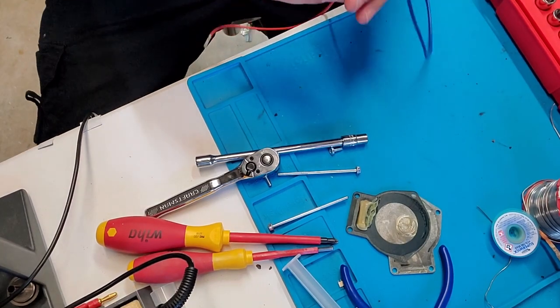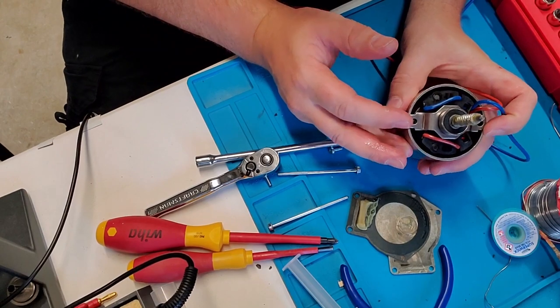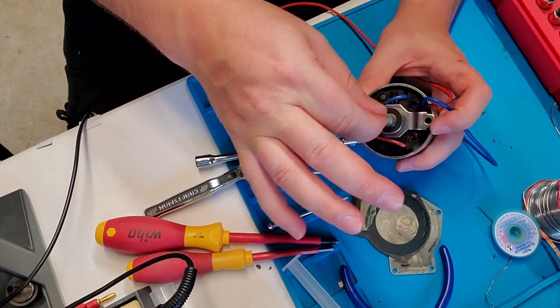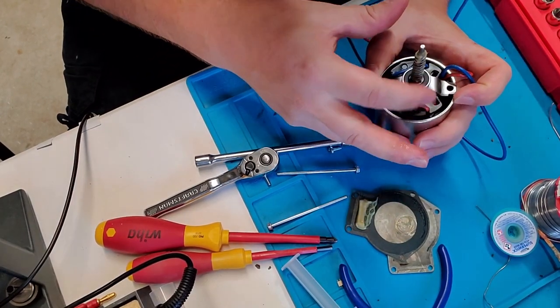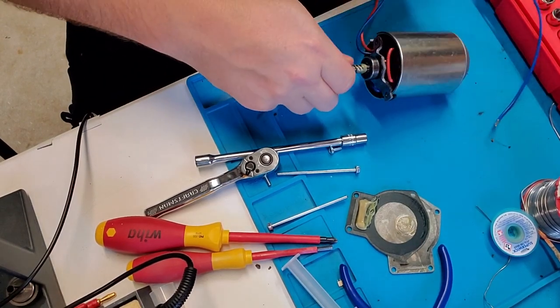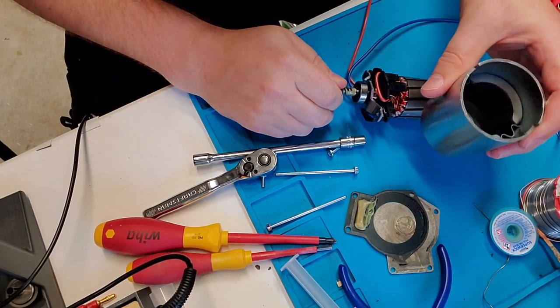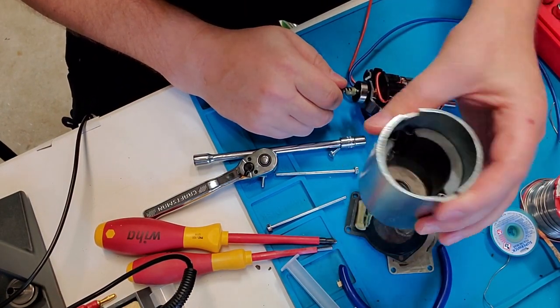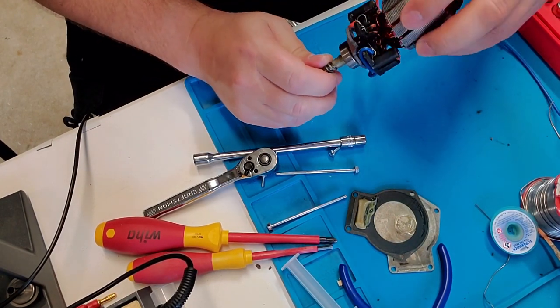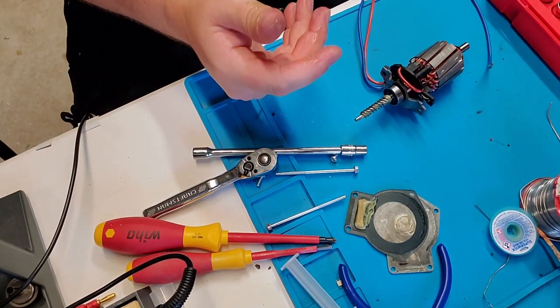All right, so this is actually a pretty well-built motor. You can see right here, there's a supporting bracket at the top next to an output bearing for the shaft, and it's a nice sealed bearing too. Let's go ahead and pull this whole guy out. Okay, some very strong permanent magnets down in the housing. It took quite a bit of force to pull those out. So right here you're going to see, oh man, I got grease all over, hold on.